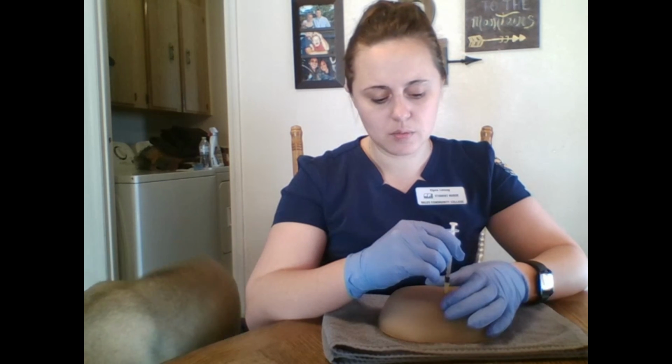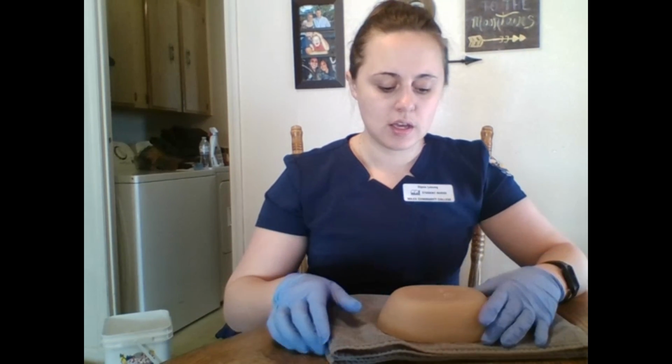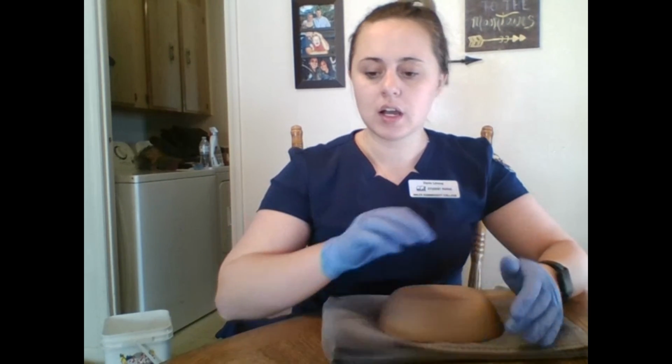All right, so then we'll go ahead and pull it out, and I would dispose of my syringe and needle into the sharps container. I would go ahead and document the location and the medication that I administered into the patient's chart.